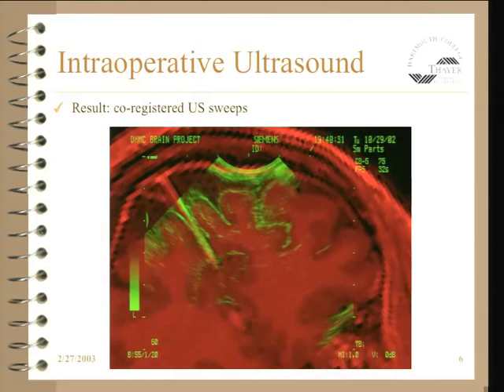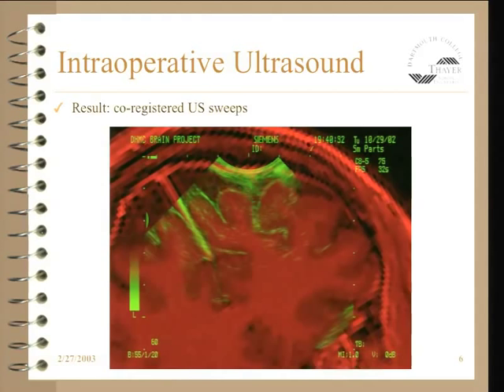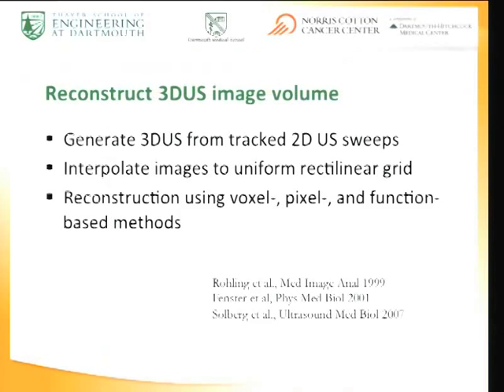It's maybe some artifact, or maybe this patient has a metal rod in her head or something. Not the fox. And you can see the details. So this became a very useful visual aid.